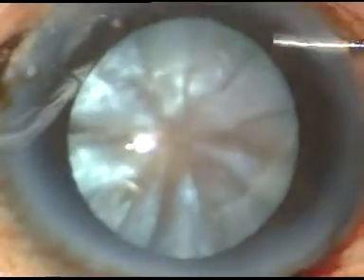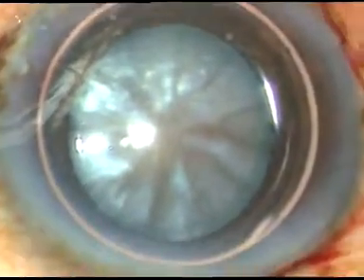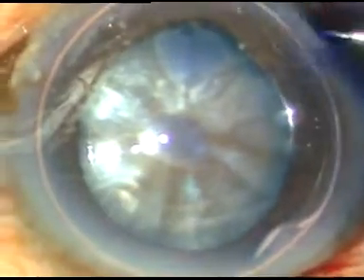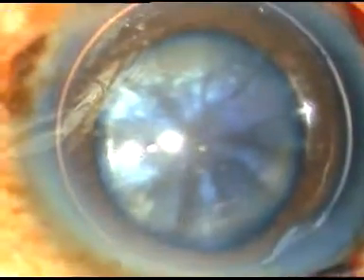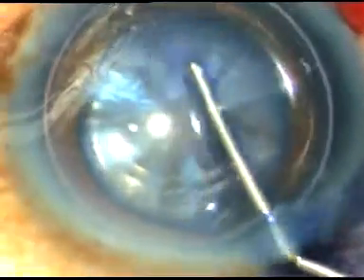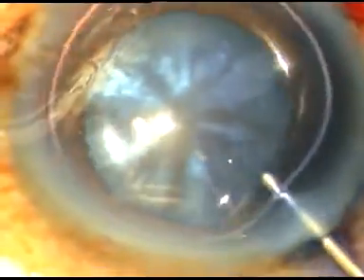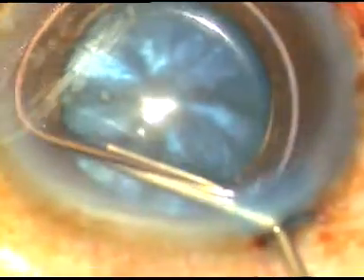This is an air bubble, and underneath this air bubble I am going to inject trypan blue dye. Here goes the 0.06% trypan blue dye. The dye is sprayed evenly over all parts of the anterior capsule. The dye doesn't get diluted because there is an air bubble in the anterior chamber, and the staining becomes very fast.